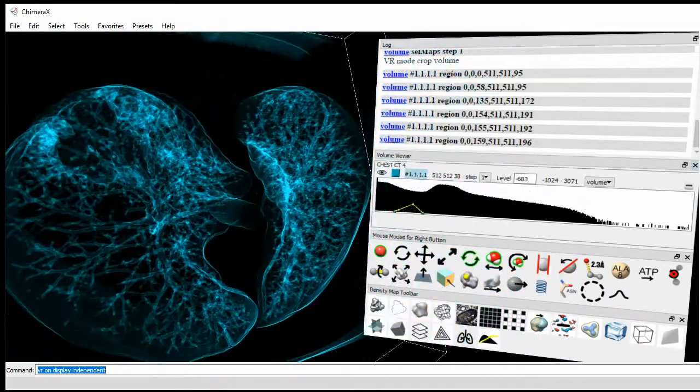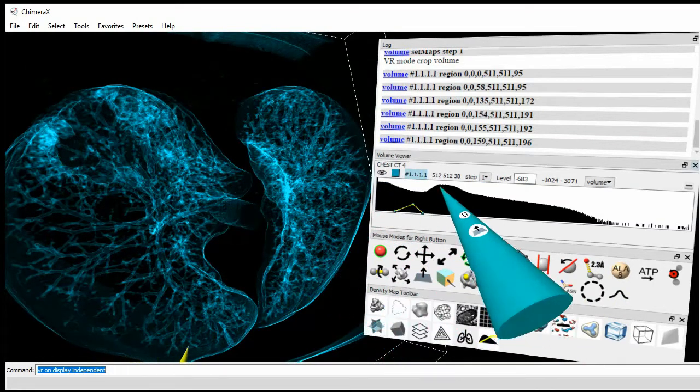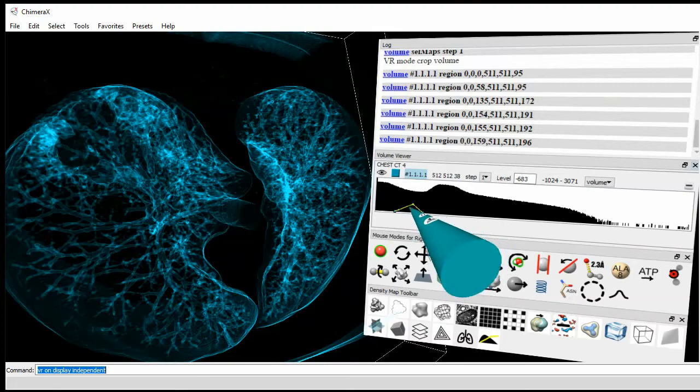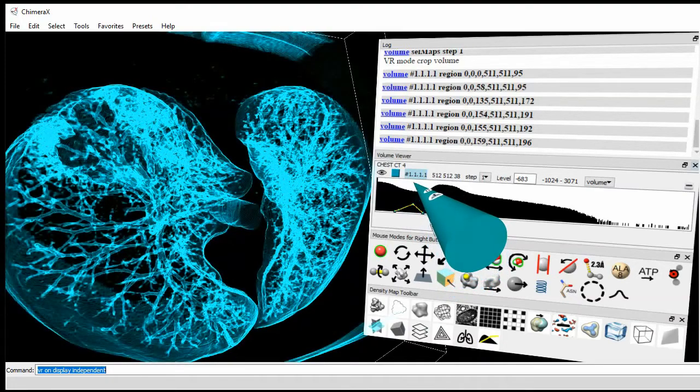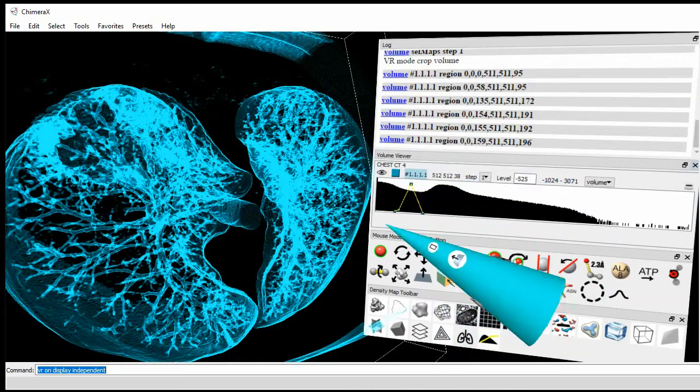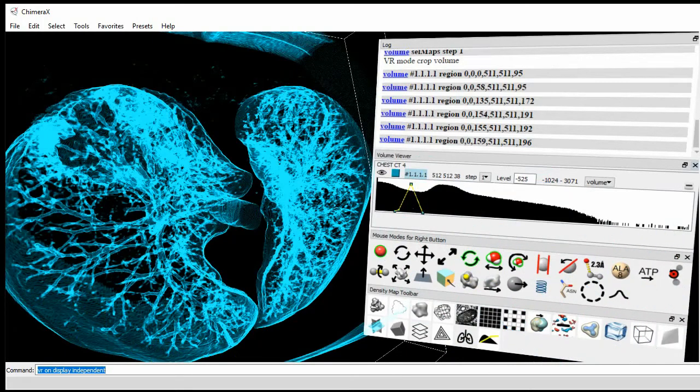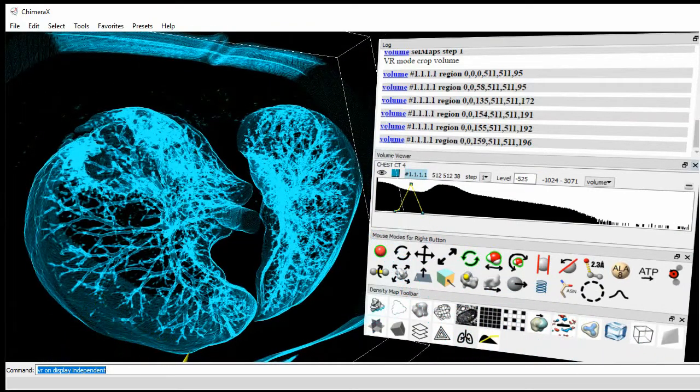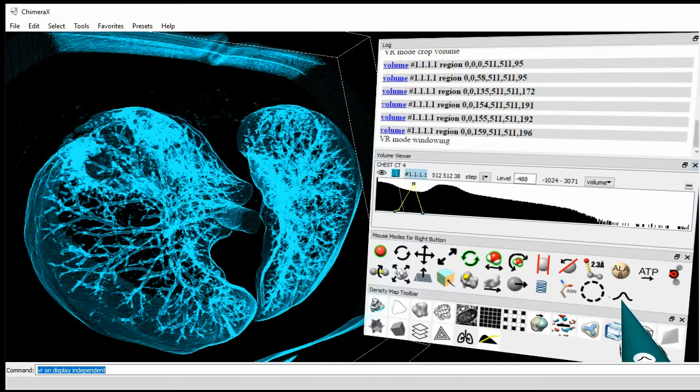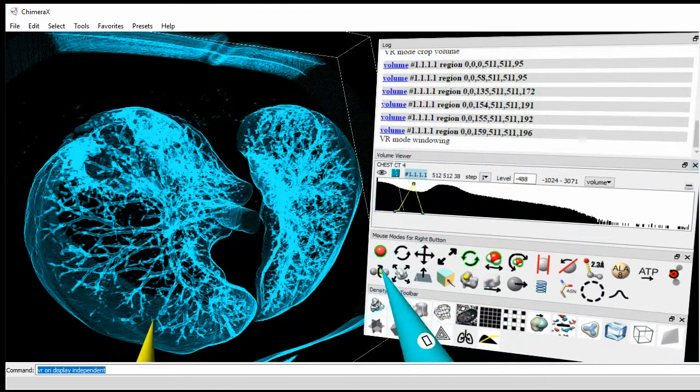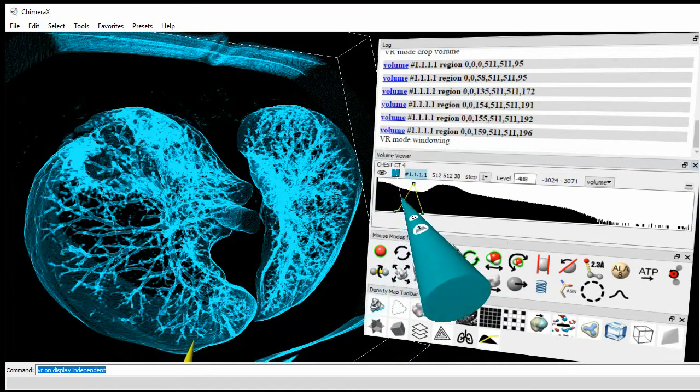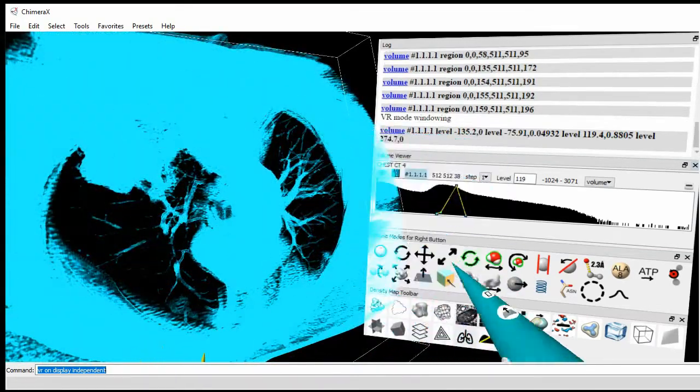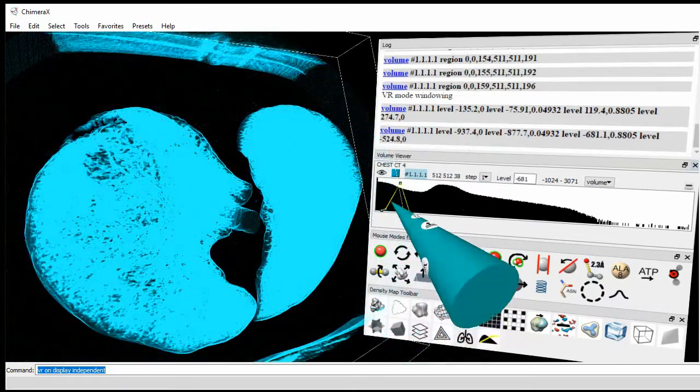Let me show you now how to change the coloring and brightness. One thing we can do is just change the yellow curve directly on the histogram. This requires some pointing accuracy, but if I click on the node on the yellow curve and drag it, I can drag it up. The yellow curve is higher. The height of the yellow curve is the brightness. The horizontal axis is the data values in the image.